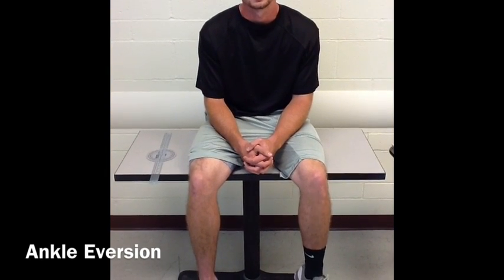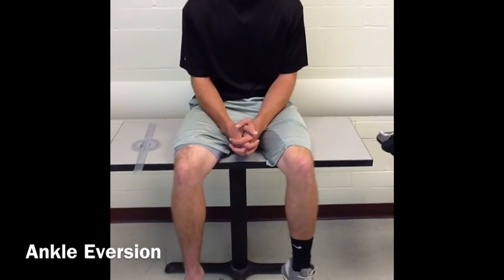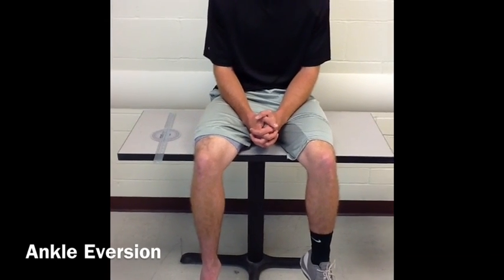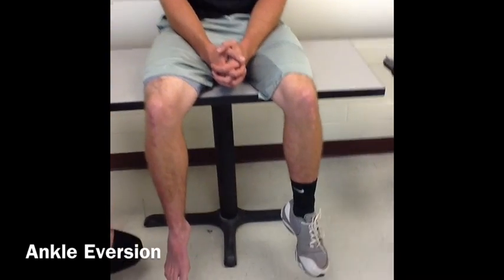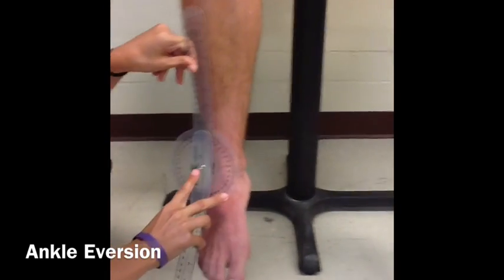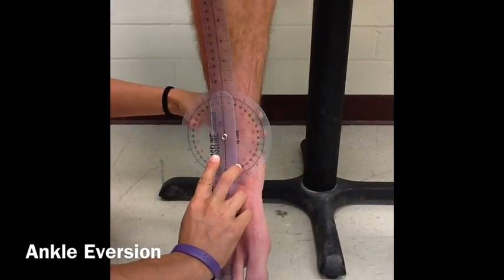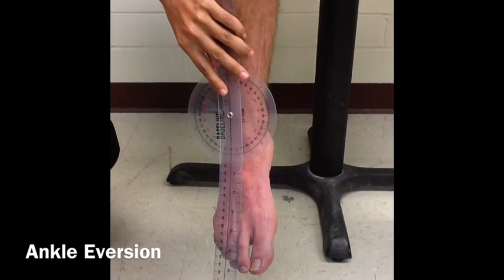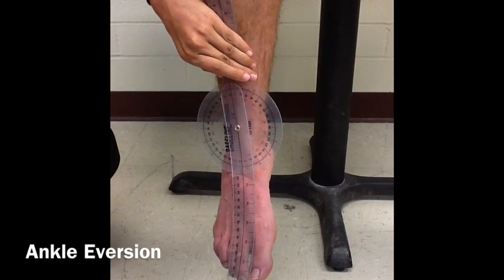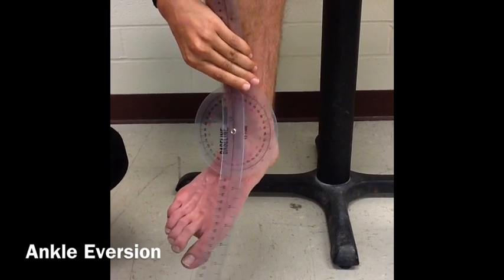Now, we will be measuring eversion of the ankle. Our patient will again be in the short sitting position and they will use the same strategy to measure eversion as inversion. So, place the fulcrum of the goniometer between the two malleoli, with the stationary arm in line with the midline of the tibia and the movement arm in line with the second metatarsal. Then, instruct the patient to move their foot outwards and record range of motion.